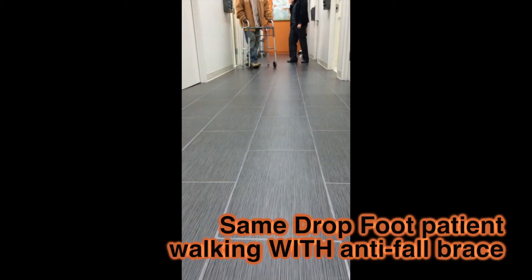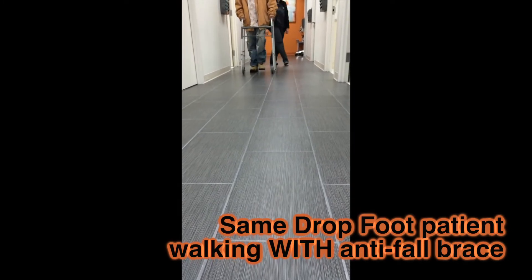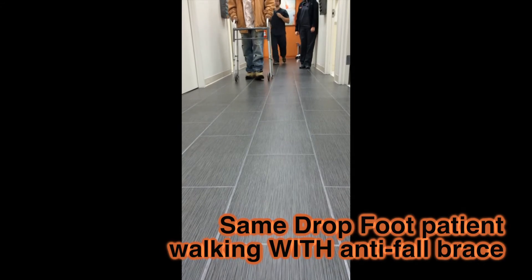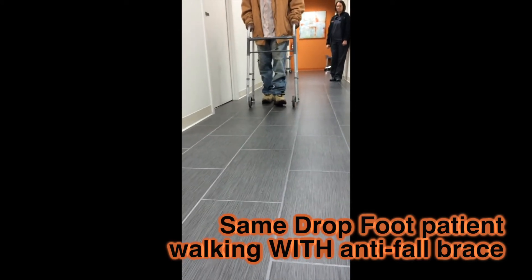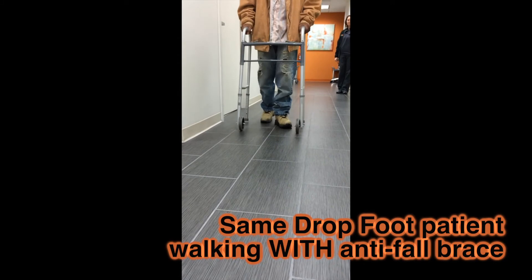Here comes the same young man, and now he's got his anti-fall braces on. You can see that he's walking so much better. How do you feel? I'm all right. You feel better? Yeah, my feet are... Do you feel more stable now when you're walking? Yeah.